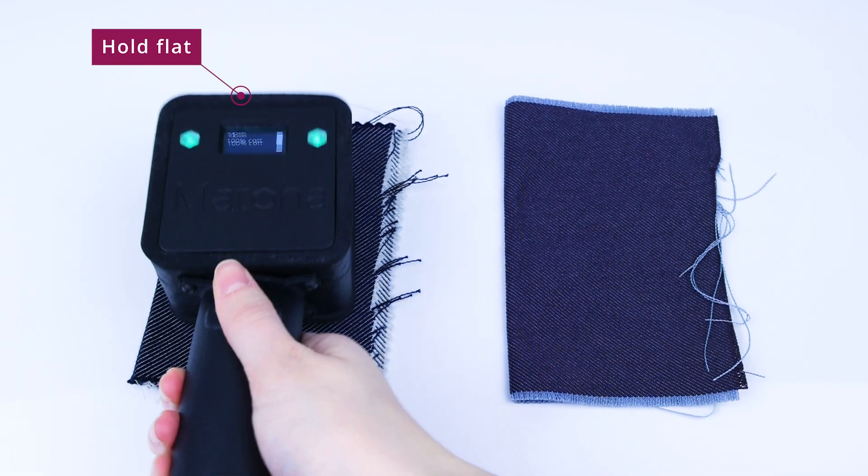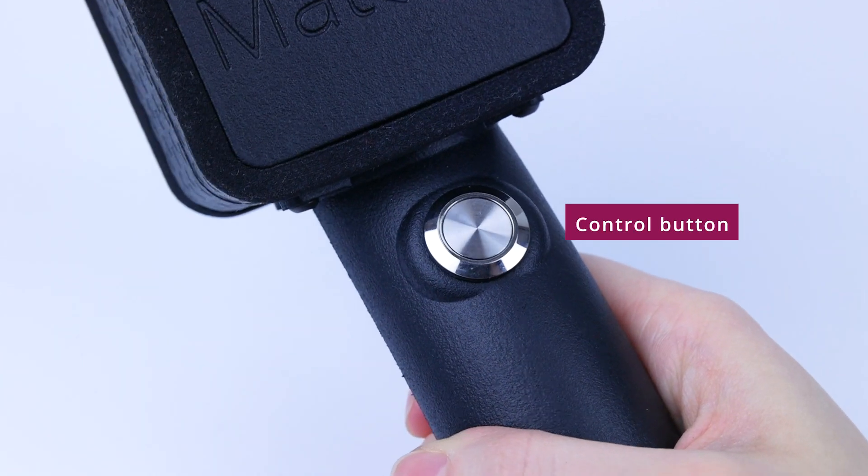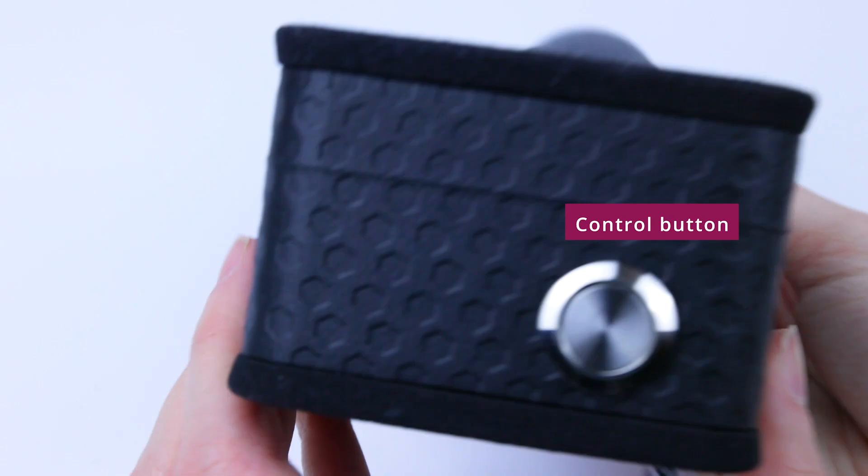Simply hold the handheld flat against the sample and press the control button. Measurements can also be done by pressing the button located at the side of the device.